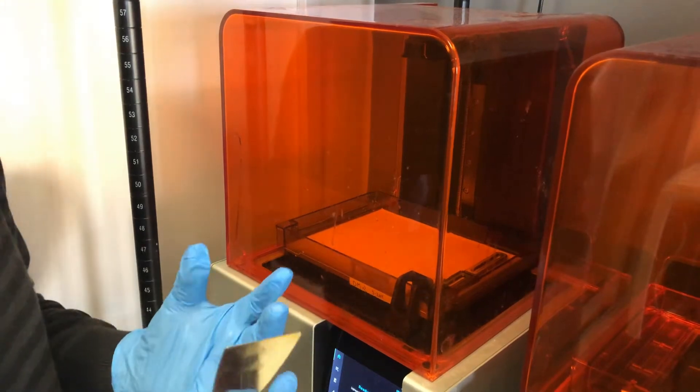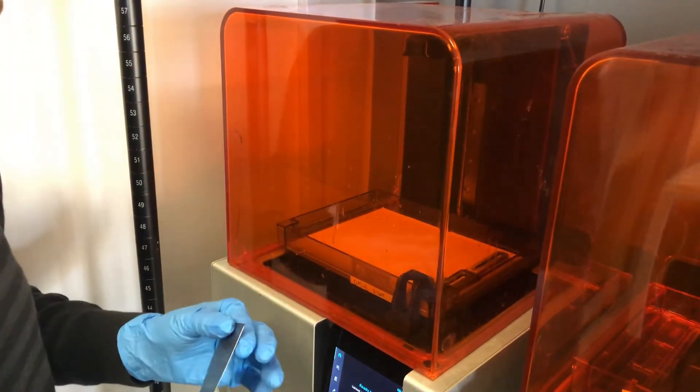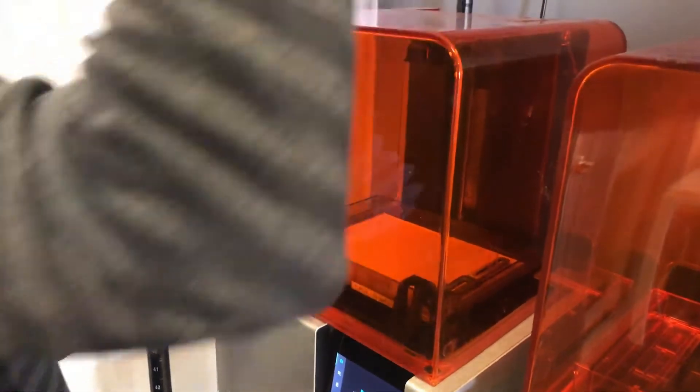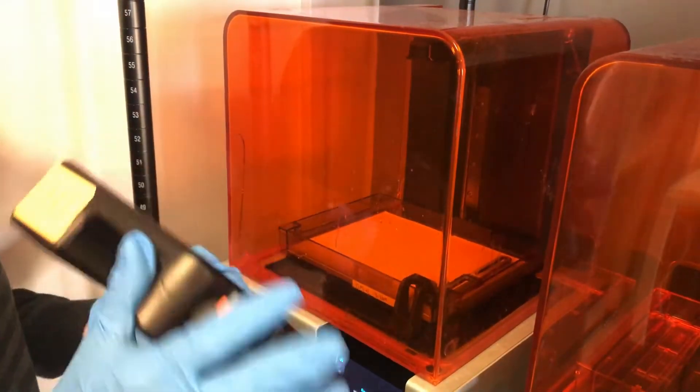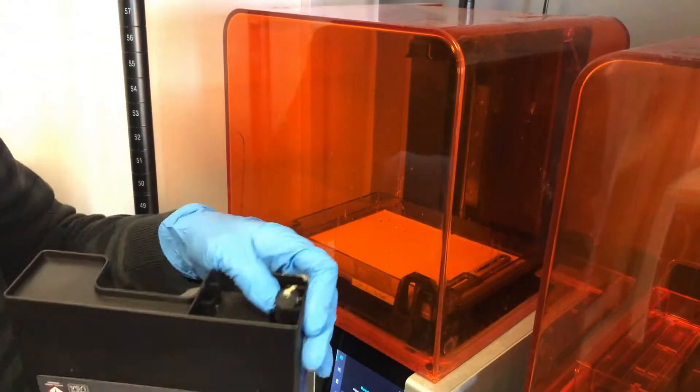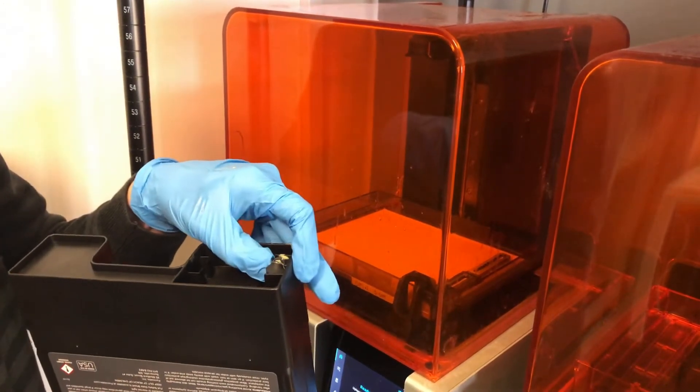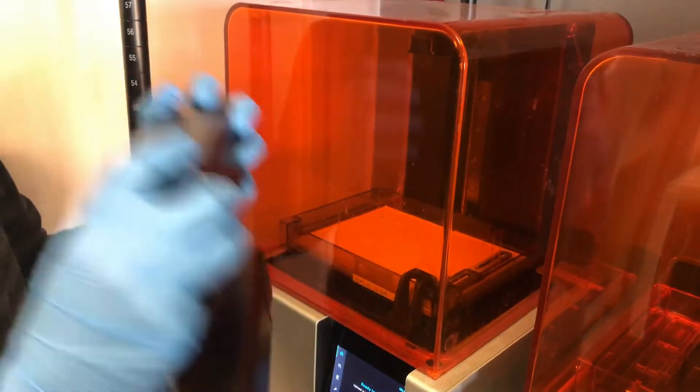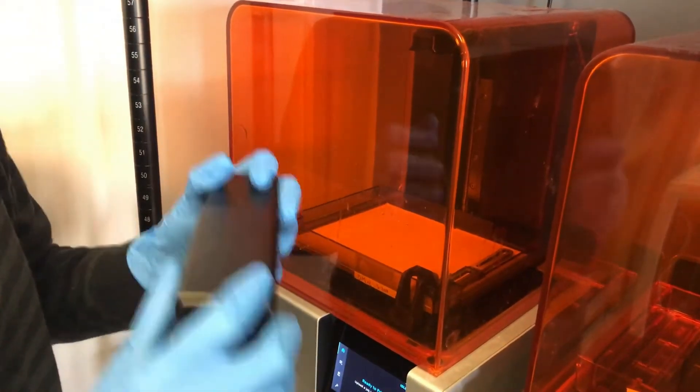Three steps that I do before every print, especially using dental model resin. I always check my cartridge, close the valve, and check the bite valve itself. I'll pinch it just to make sure it's flowing and there's no debris in the way, and then I'll give it a good shake.